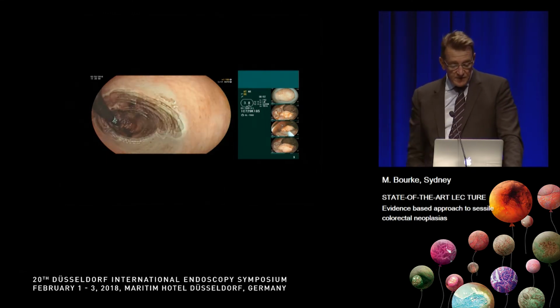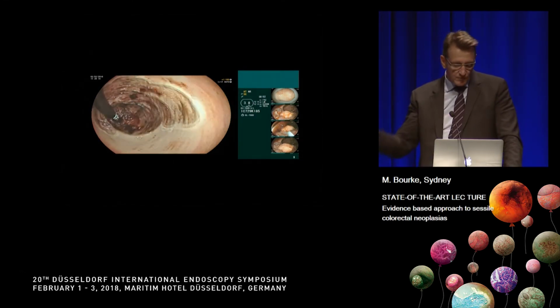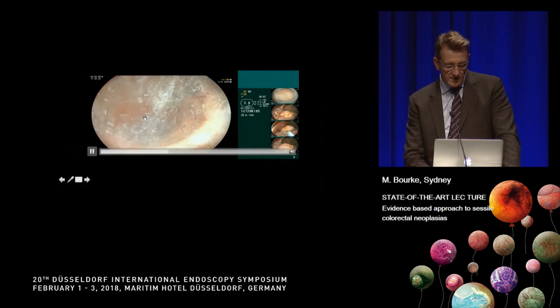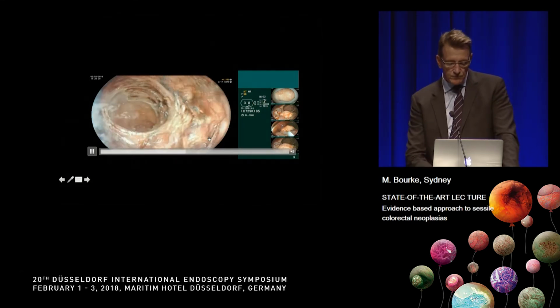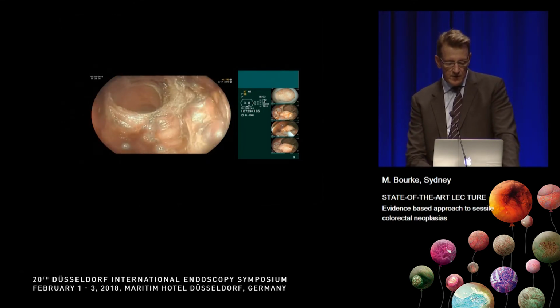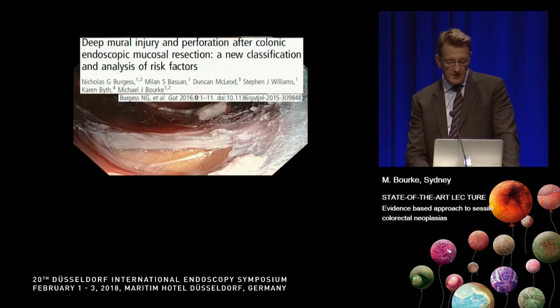So this ended up being a circumferential resection. I haven't heard the histology yet, but it extends upwards for more than 5 or 6 centimetres from the anal verge, and then downwards to the anal canal, across the hemorrhoids and onto the squamous mucosa. The patient's completely fine today, no pain, a little bit of discomfort in the rectum, actually ready to go home, and we put this patient on steroid budesonide enemas for about 6 weeks. These are hemorrhoids here. Probably will need a dilatation.